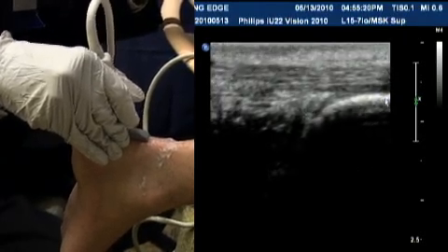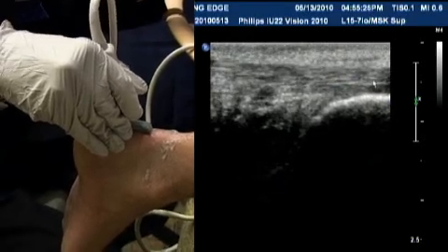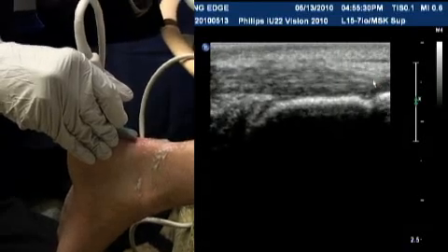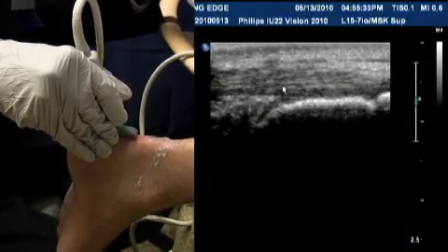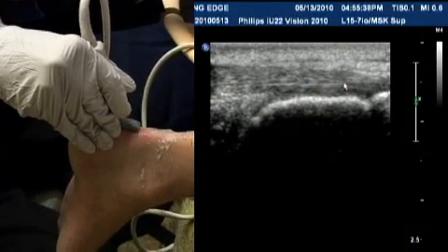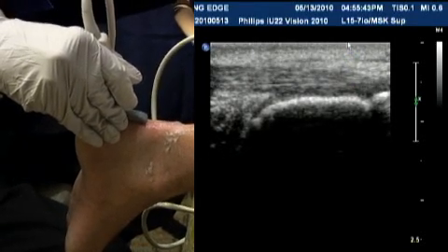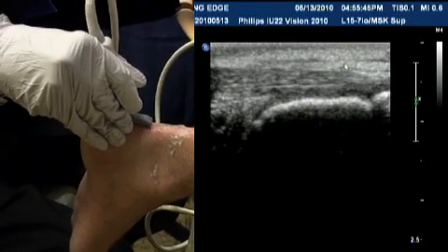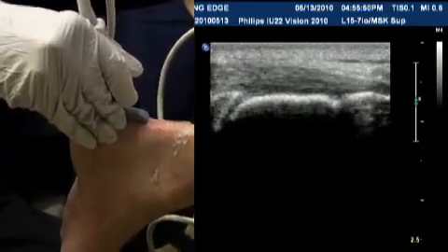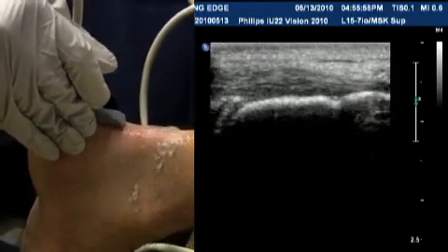The calcaneum is where the tendon insertion takes place. So you can see the tendon coming down and inserting onto the calcaneum. Now when it inserts, a couple of things happen. One is the tendon gets very narrow, and the other is that at the insertion point the tendon starts to curve down. That means the tendon fibers are now not perpendicular to the top part of the probe, so sometimes you will get an image where the tendon starts to look dark. That's not to be confused with pathology; that's just the way the tendon appears because it's curving down.